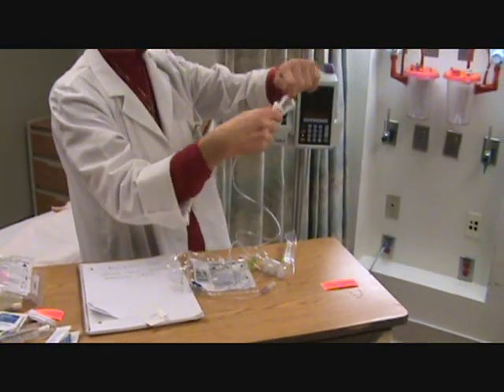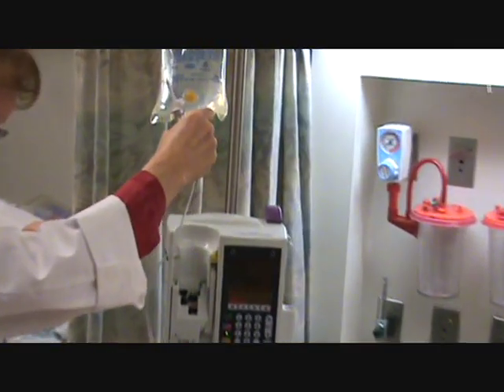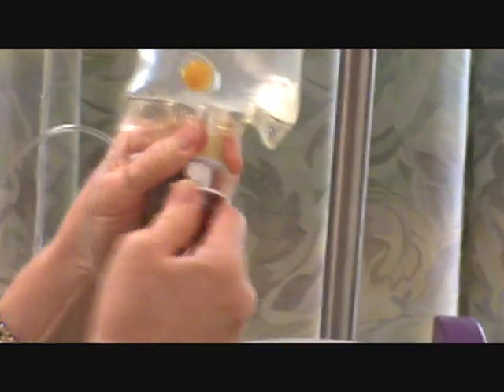We take off the cap, keeping it sterile, and insert with a little pressure — insert and twist as you're putting it in, all the way up.